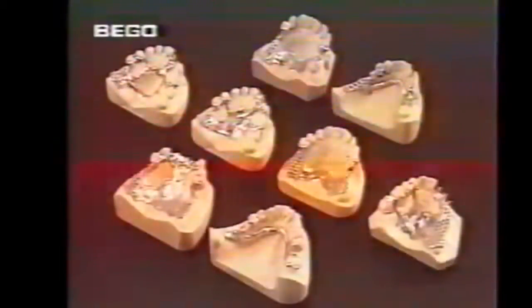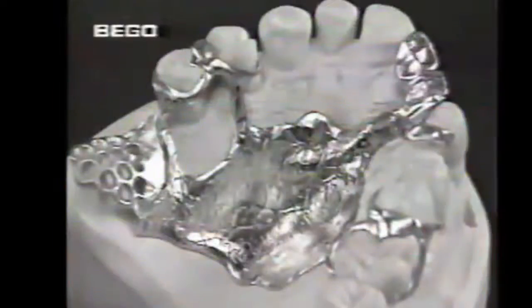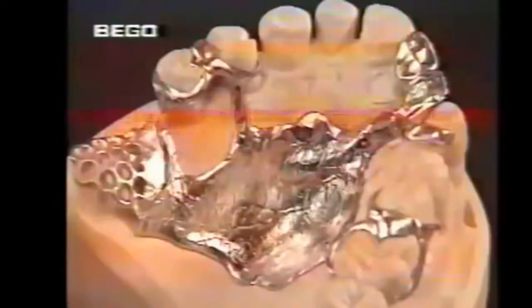The frame is now placed on the master model and checked for accuracy of fit. The tip of the clasp chafes at this point when the frame is placed on the plaster model. The clasp bends up here at the natural tooth and slides over the greatest diameter into the retention area. Since clasp prostheses are not secured on the remaining dentition as firmly as attachment or telescopic work, clasp arms, rests and the base must fit accurately without inducing stresses.